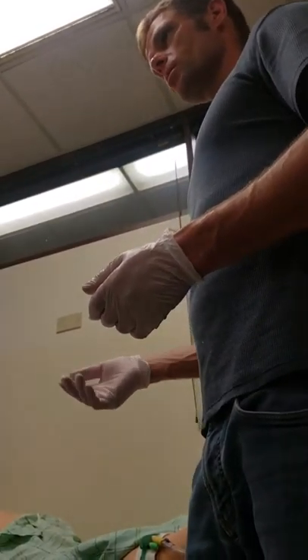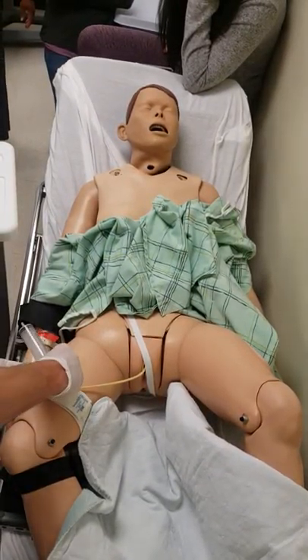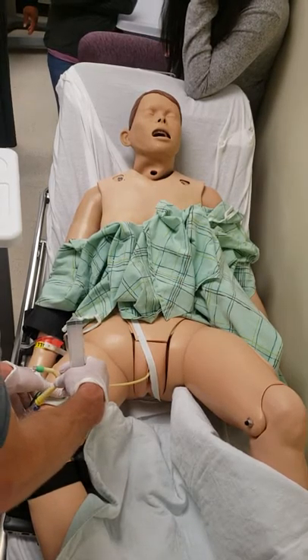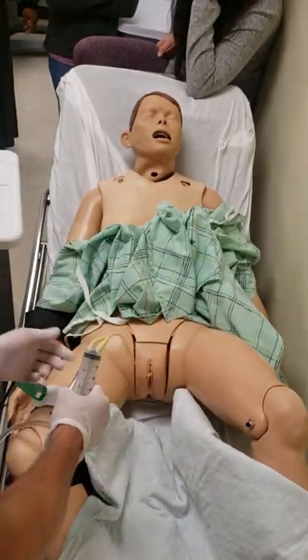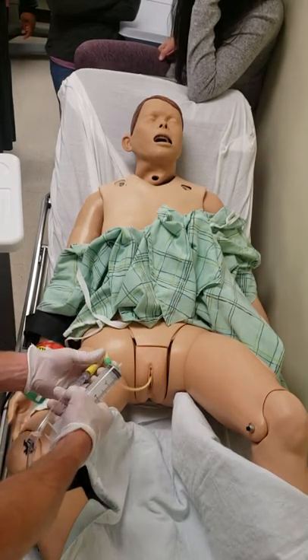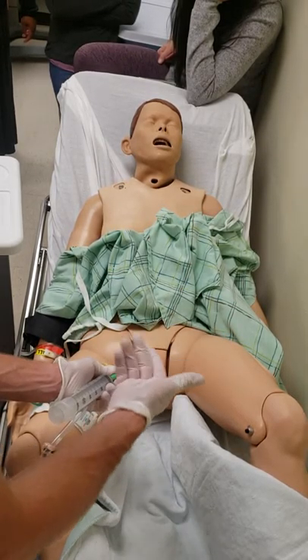For DC-ing the Foley, I would look in the chart to see how many mLs the nurse actually filled the balloon with. I can also check here — this tells me it should be five mLs, but sometimes nurses put more than five in there. So I go in with a 10cc syringe and draw up. I squirt it on the chucks. It's sterile water, or sterile saline — whatever it is.